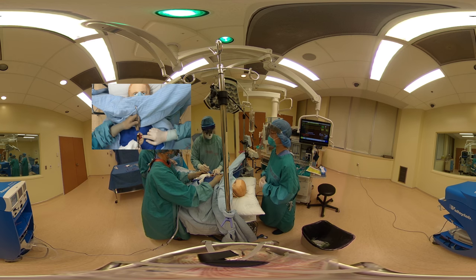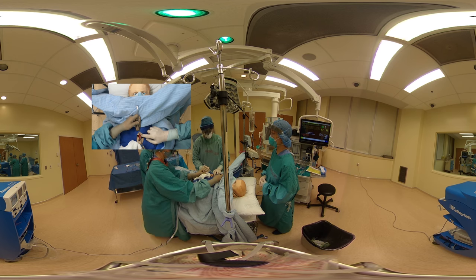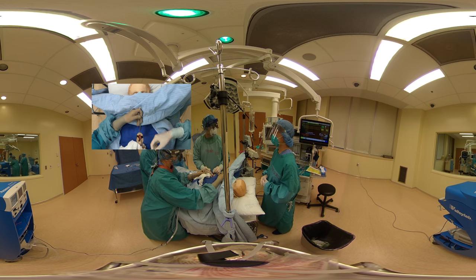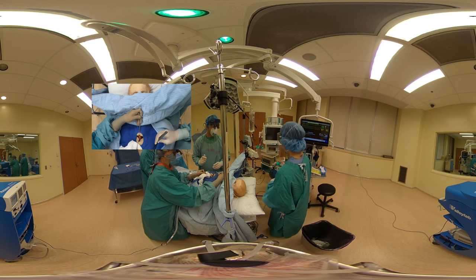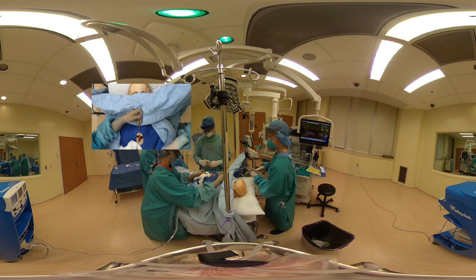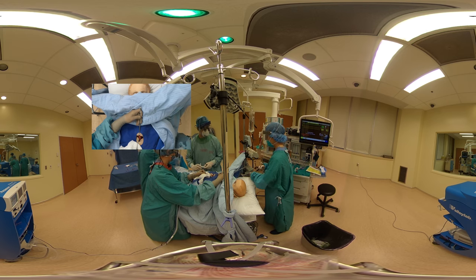We have good exposure of the trachea — normal-looking anatomy, very good exposure, thin and favorable neck. It looks like it would be an easy insertion of the tube. To minimize coughing from the tracheostomy site and contamination from the wound, in this particular case we could induce general anesthesia with paralysis now, and then proceed with the tracheotomy very rapidly once the patient is sedated. We have our backup measures if the insertion is difficult.